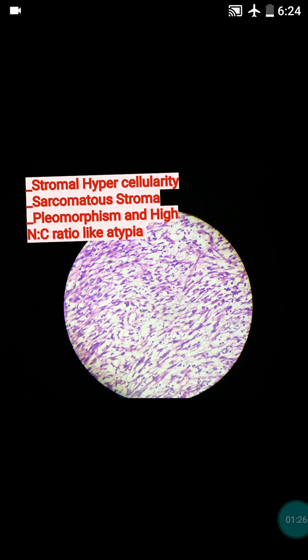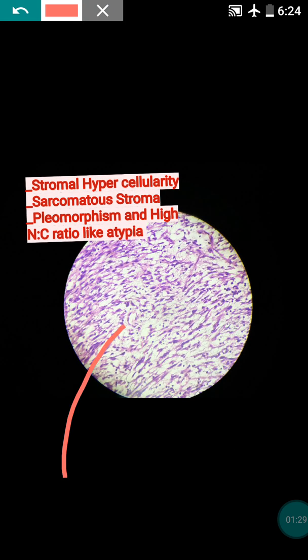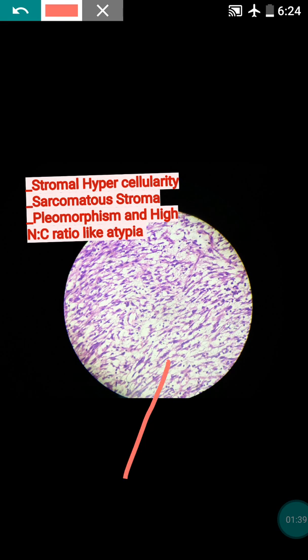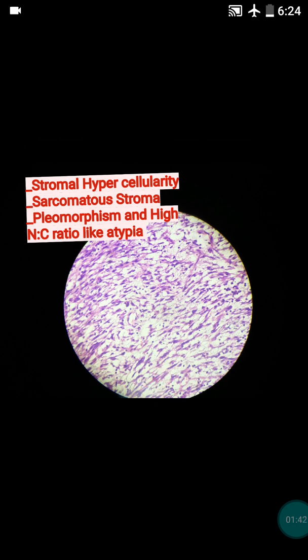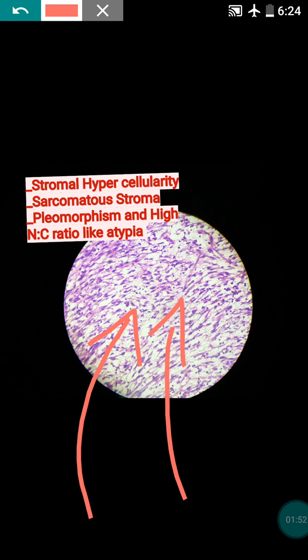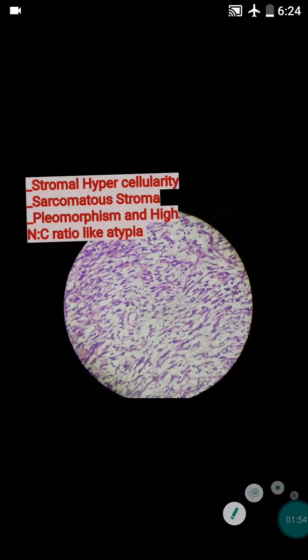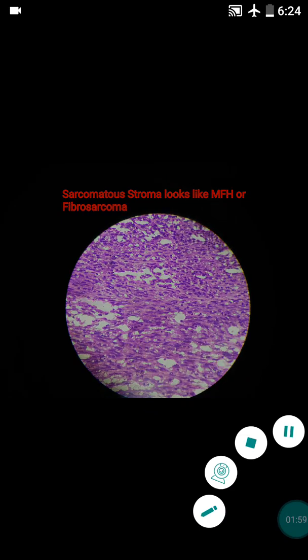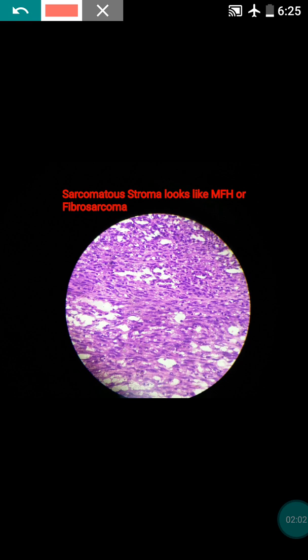In this case of malignant phyllodes, you can see that the stroma is very hypercellular — all spindle-shaped stromal cells are hypercellular — and you can see features of atypia such as high N:C ratio, nuclear pleomorphism, and hyperchromasia. The stroma is sarcomatous and can resemble malignant fibrous histiocytoma (MFH) or fibrosarcoma.